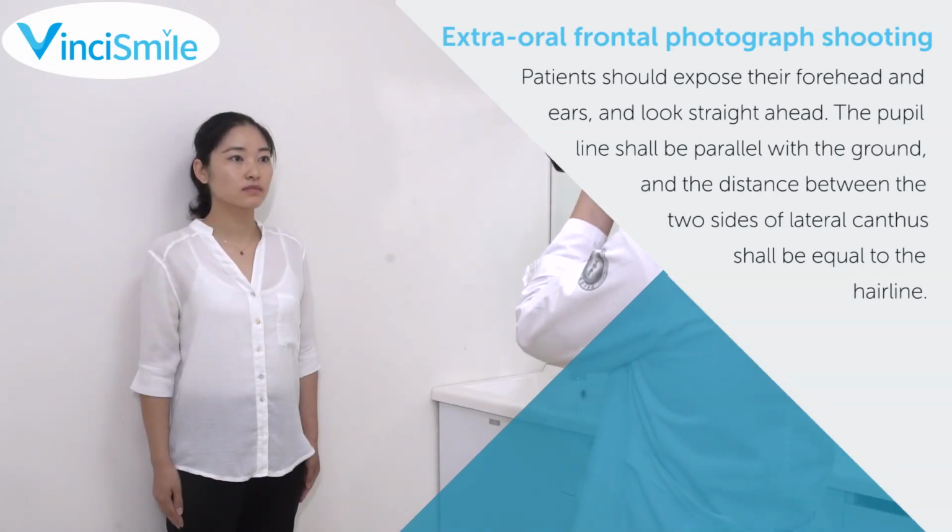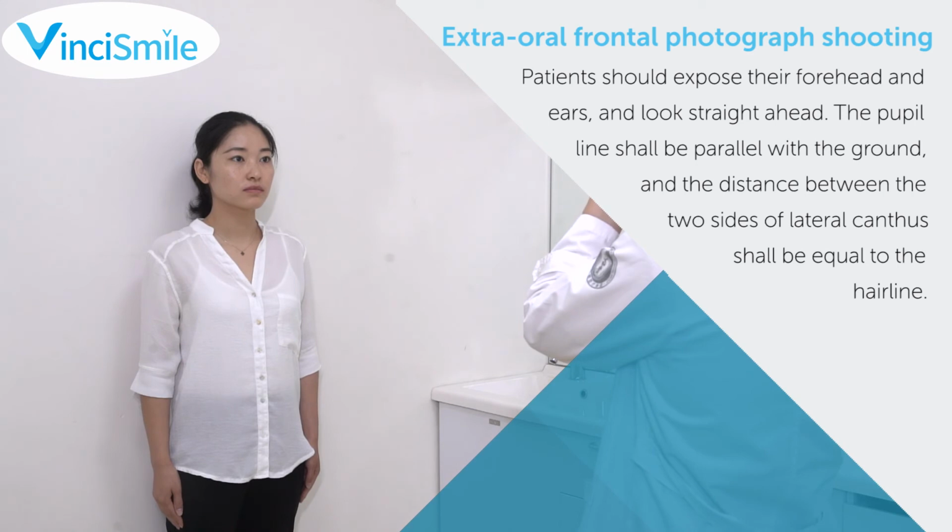Extra-oral frontal photograph shooting. Patients should expose their forehead and ears and look straight ahead. The pupil line should be parallel with the ground, and the distance between the two sides of lateral canthus should be equal to the hairline.